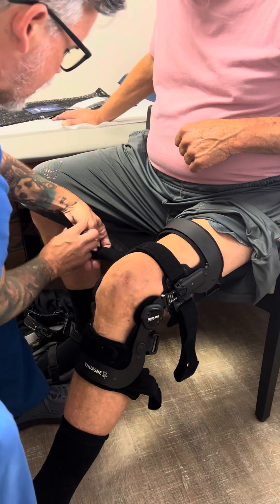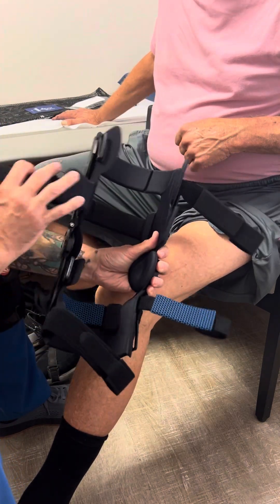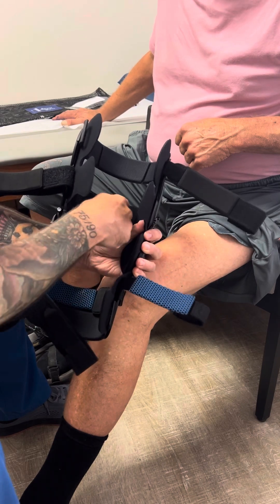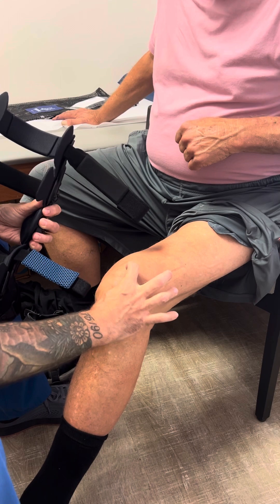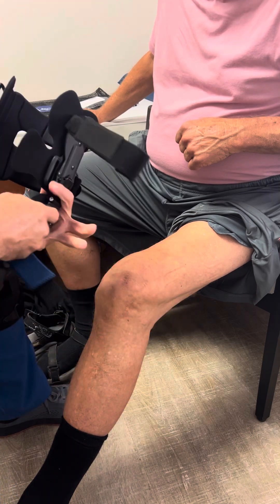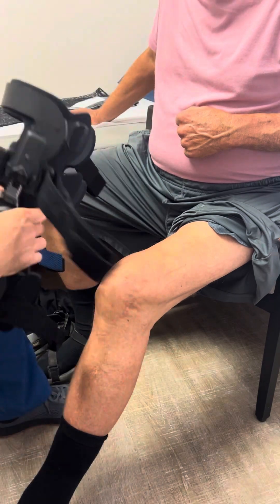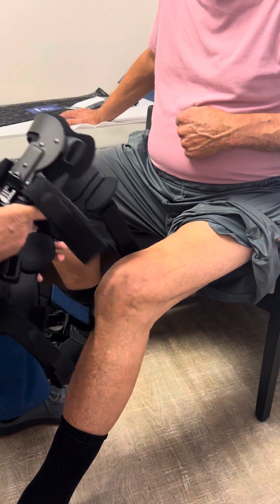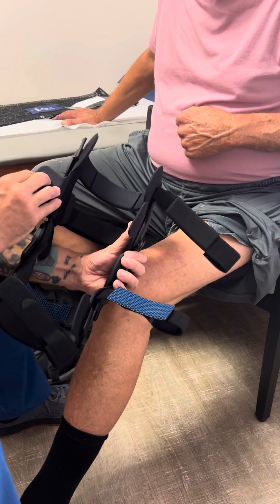Every time we take the brace on and off — the patient just has to set it on their leg and the two front straps are already set up. You want to line up right across your patella and line up the hinge right to the side of it, so it's going right where the knee bends. You want that brace to bend right where the knee bends, and also make sure that when you put it on you don't fold any of these flaps — keep them open.